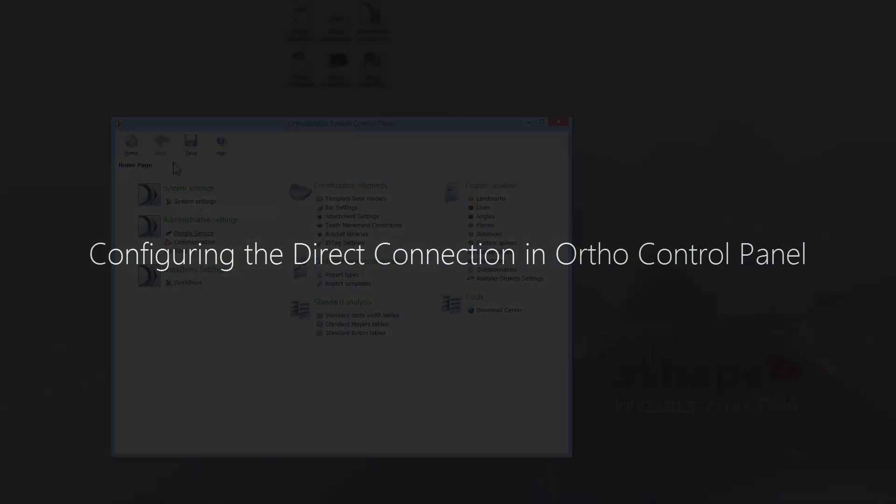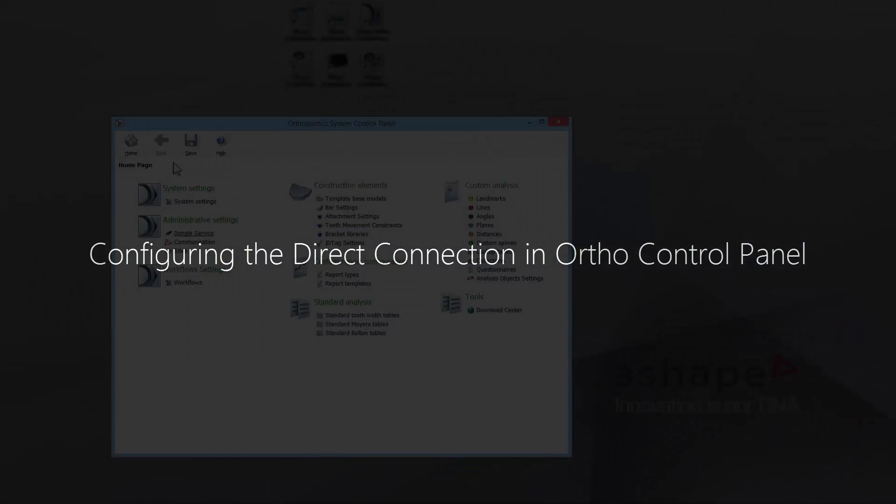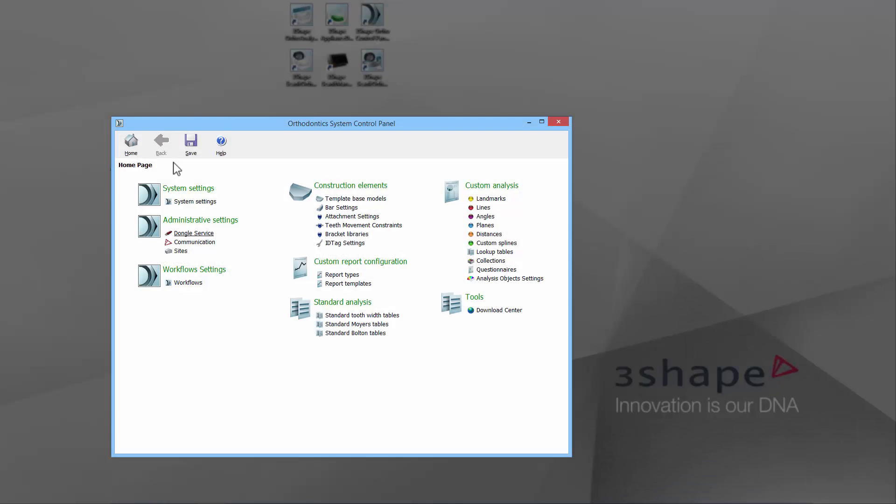In order to configure the Direct Connect in TRIOS, you should configure the Direct Connection in the Ortho Control Panel first. Enter the Communication page in the Administrative Settings of the Ortho Control Panel.